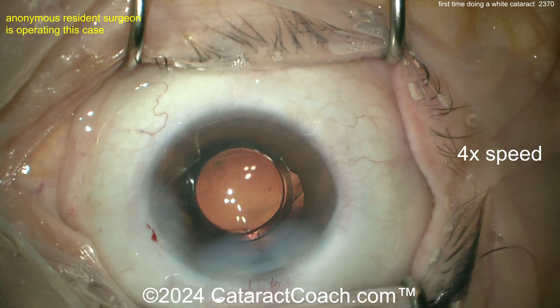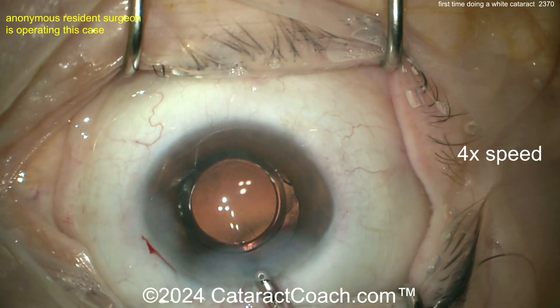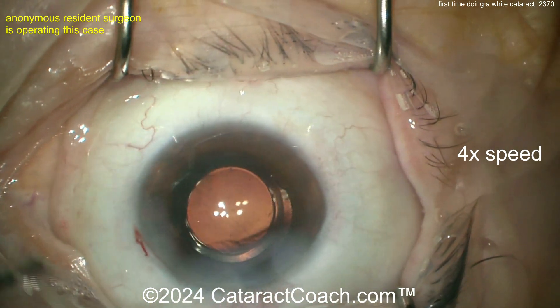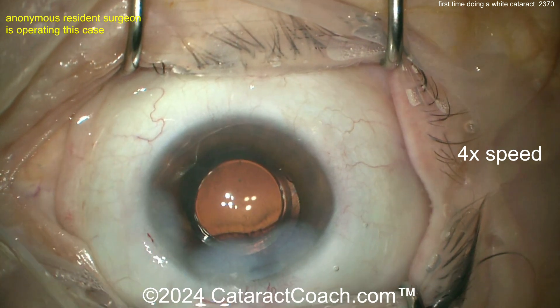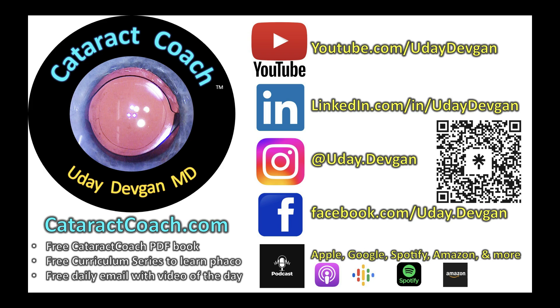But I don't like this hydration. You're hydrating the sides of the incision, but the main incision roof is the only thing not hydrated. Learn the Cataract Coach way: hydrate the roof, not the sides of the incision. A light hydration on the roof is far better than this excessive side hydration — that technique causes irregular astigmatism on post-op day one, and not a happy patient. So improve that — go to the CataractCoach website and download the free PDF book.